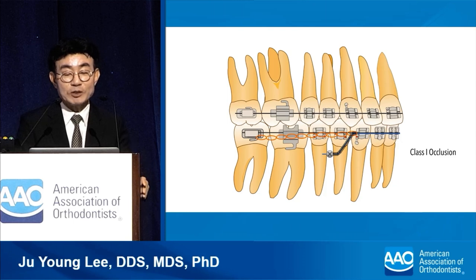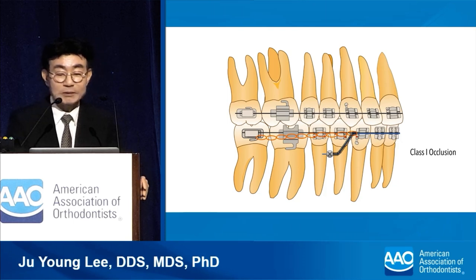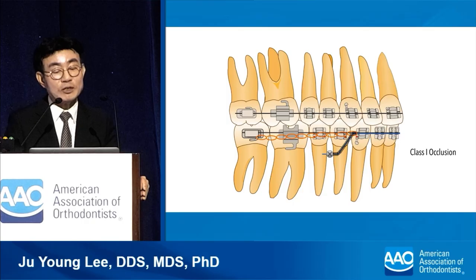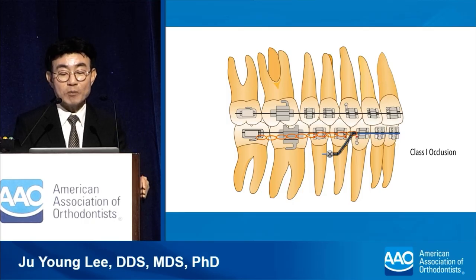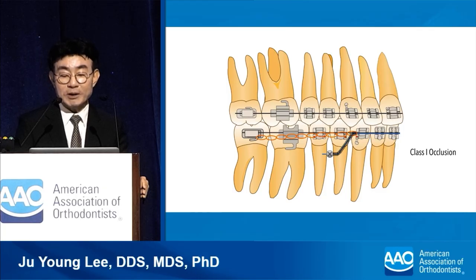Following the protraction of the posterior teeth, the class 1 occlusal relationship was achieved. By adjusting the amount of open coil spring, the position of the canine and anterior teeth can be adjusted forward or backward at any time. While maintaining the vertical stability of the mandibular anterior teeth, the posterior teeth can be moved forward effectively.